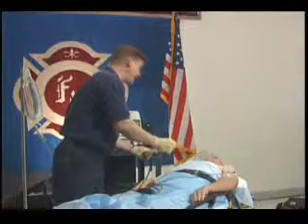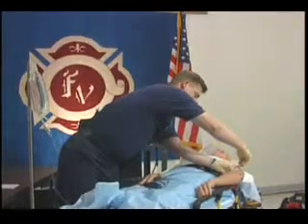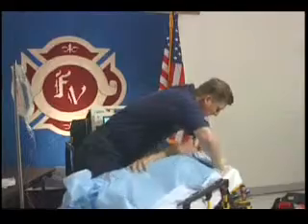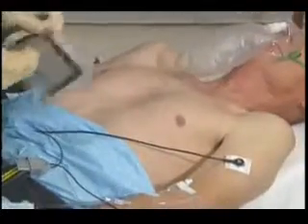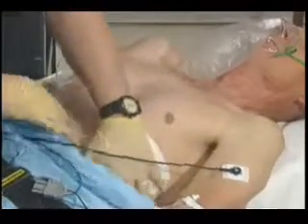To perform transcutaneous pacing, the limb electrodes must be attached. Let the patient know this procedure will be uncomfortable, and if appropriate, administer an analgesic or sedative. Position the defibrillator pacing pads. Place them in an anterior-anterior or anterior-posterior position. Often, the anterior-posterior placement is considered superior for pacing. Ensure the electrodes don't touch, and avoid placement over the patient's diaphragm.